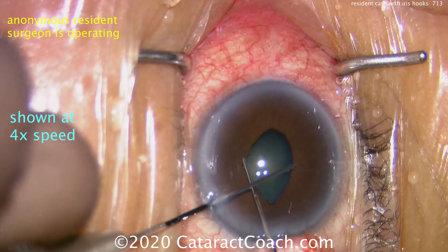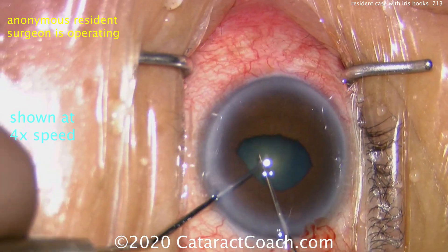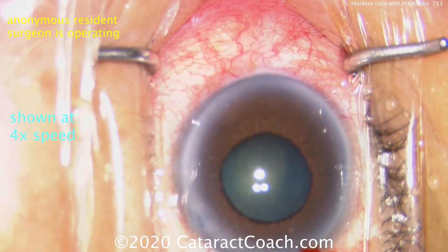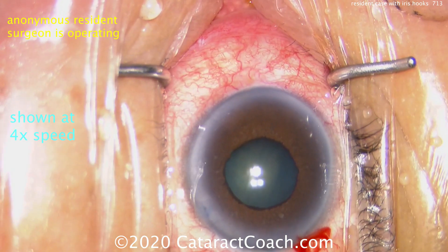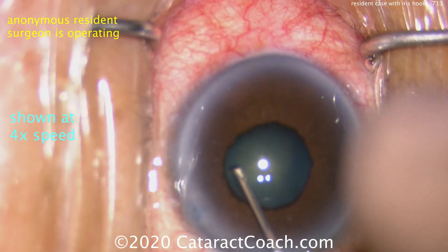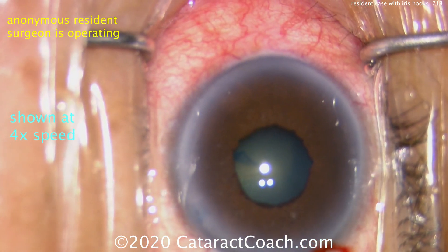Starting off with some pupil stretching in both directions. The capsule has already been stained with trypan blue dye. Now viscomydriasis — so that's a reasonable pupil, probably about 4 millimeters. This is a good time to put in iris hooks, but instead the surgeon wants to do the capsulorhexis first.